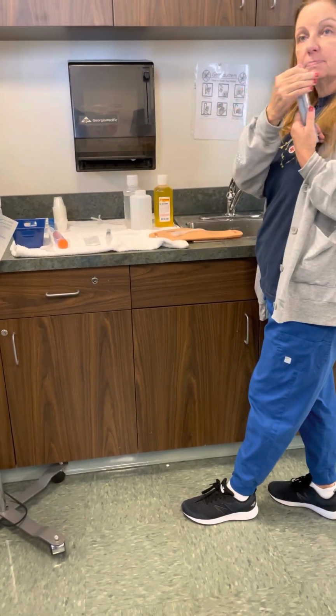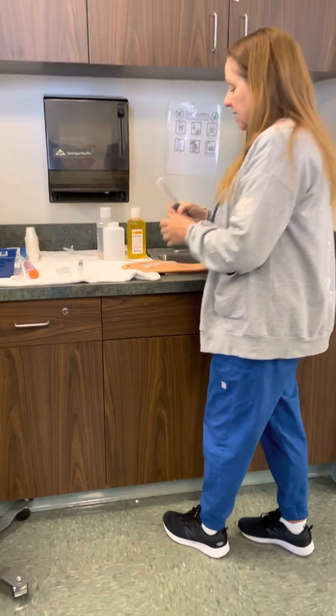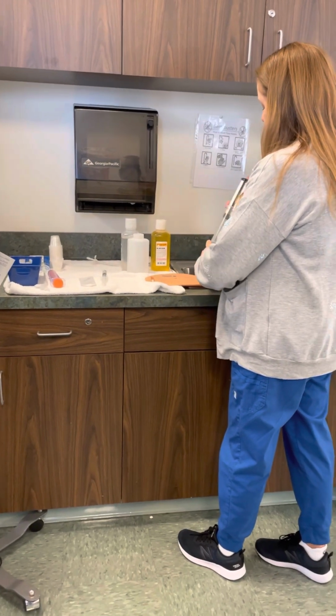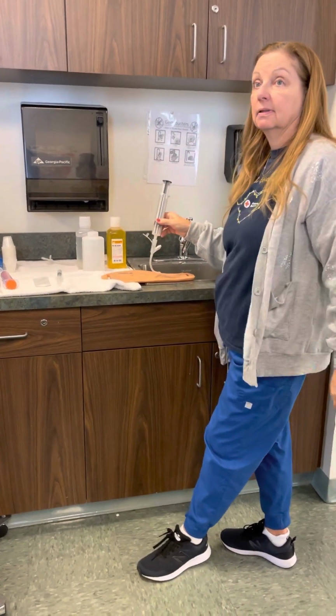This one, we can use this big catheter tip syringe. So I'll take about 50 to 60 mLs of air, and I'll inject that air, and then I'll pull back. What am I checking? Gastric contents.